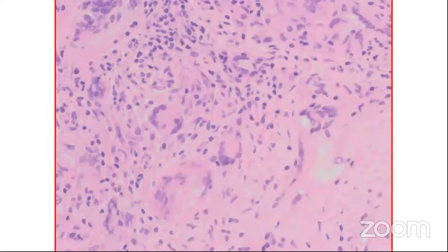The formalin fixed and paraffin embedded permanent sections show the same thing. There are numerous chronic inflammatory cells and multiple multinucleated giant cells. However, in this permanent section, you may want to see here that one of the multinucleated giant cells has fungal microorganisms inside it. And silver stain was performed, and we can see here fungal microorganisms, septated fungal microorganisms with acute angle branching.